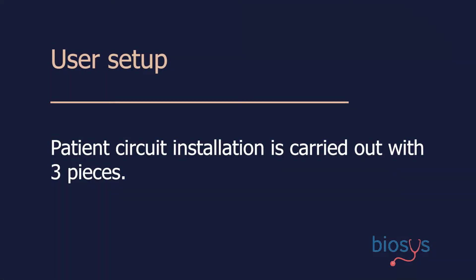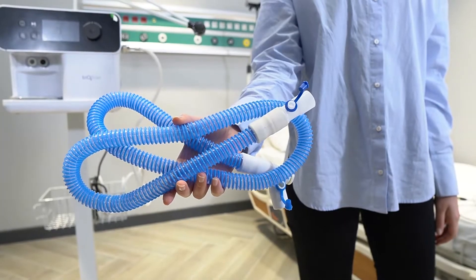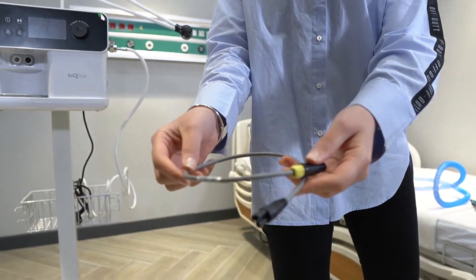Patient circuit installation is carried out with three pieces: heated wire, patient circuit, temperature probe, and heater wire adapter.